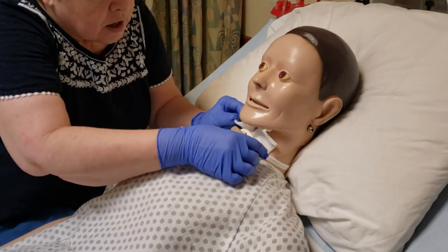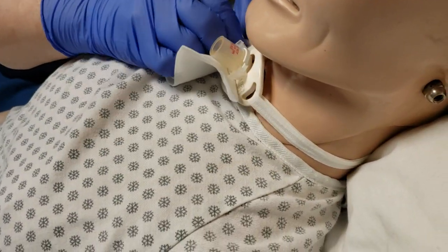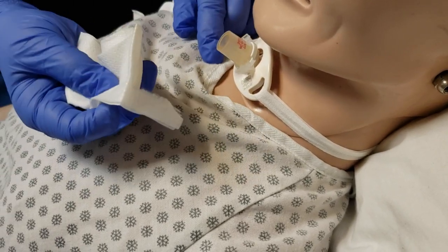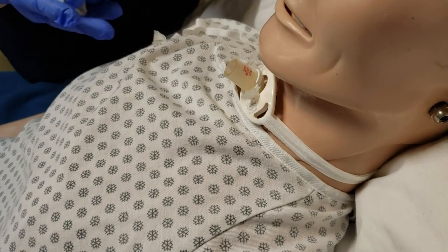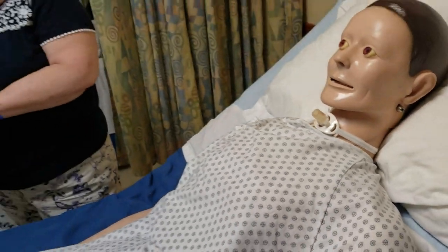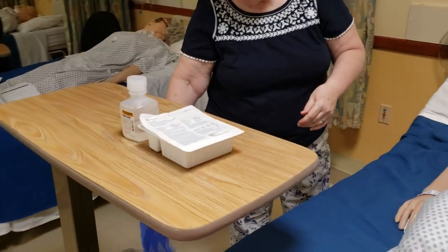I'm going to go ahead and remove the old dressing, which can be kind of tricky to get out from under here. Feel free, if there is anything there, to just wipe it off using this, and then we're going to throw this away. I'm going to go ahead and attempt to encase it in my gloves.